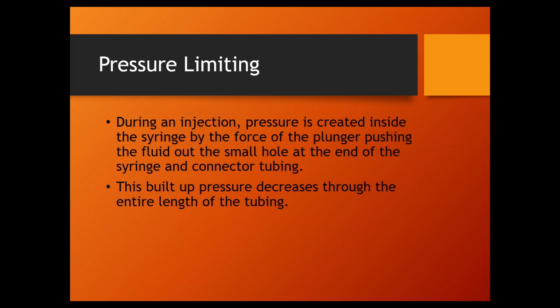So there's going to be connector tubing, and I'm not going to connect it all the way. One for each syringe, and I'll tell you why there's two syringes here shortly. Just like that. And then the connector tubing here goes to the patient.